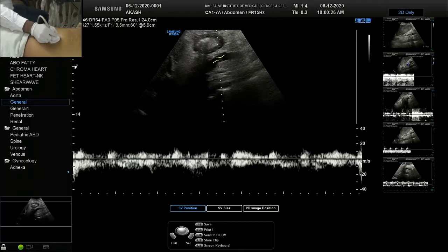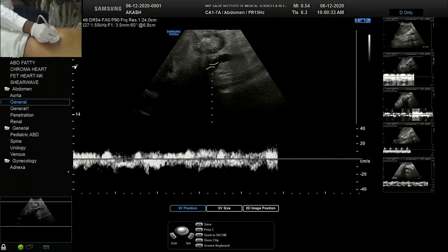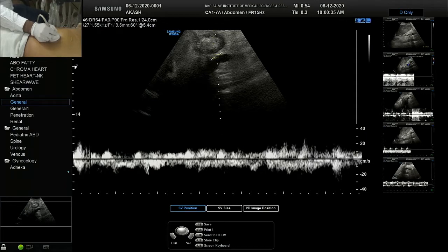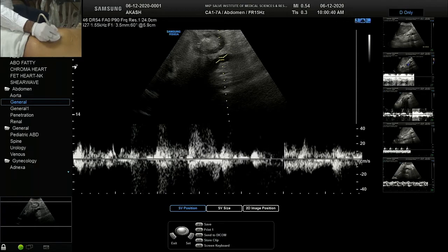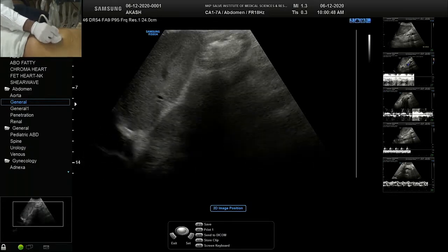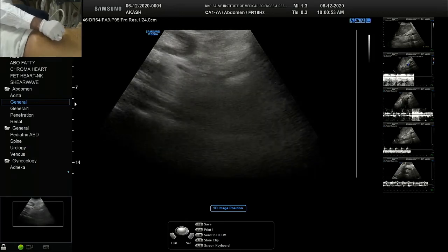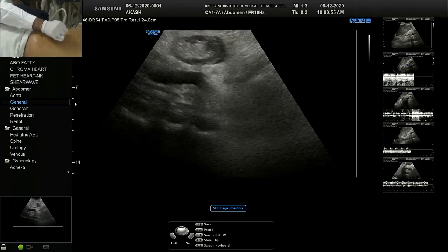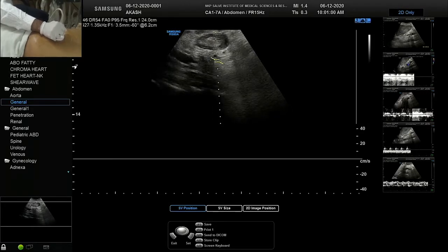We'll try it again at a better angle, and some at another place we can try that.